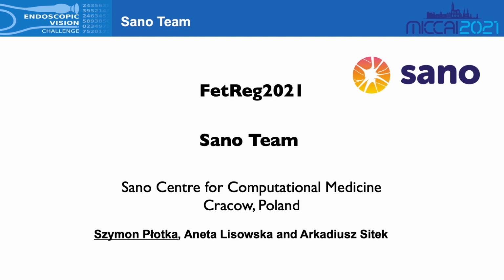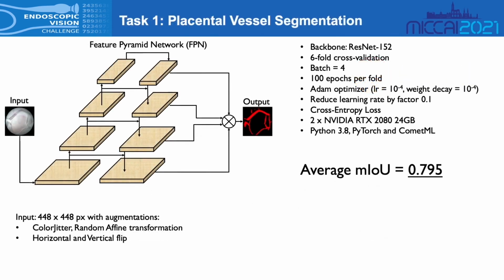My name is Szymon Płotka, and together with Aneta Lisowska and Arkadiusz Sitek, we would like to show you our solution for placental vessel segmentation and RGB frame registration for mosaicking. For placental vessel segmentation, we adopt an open-source feature pyramid network as a base neural network. As a backbone, we use the well-known ResNet 152 with pre-trained weights.